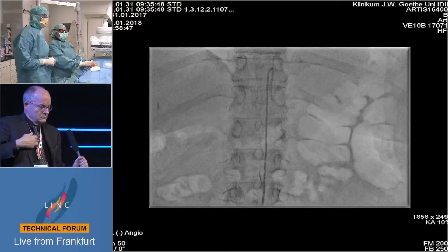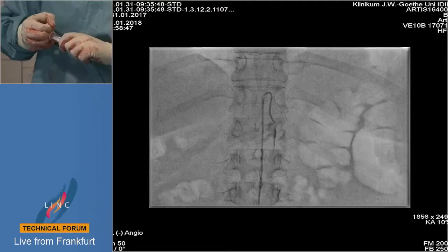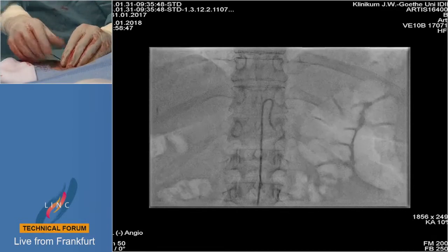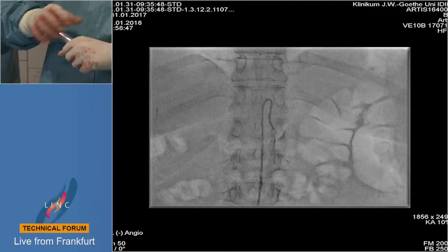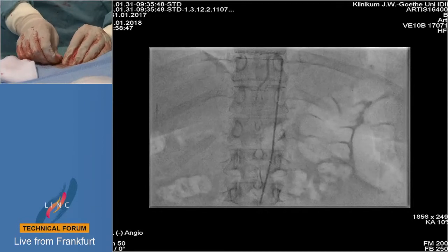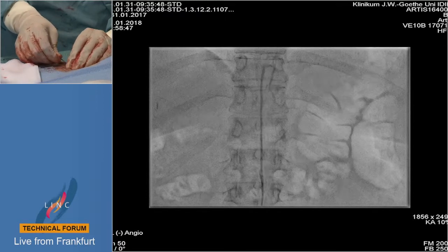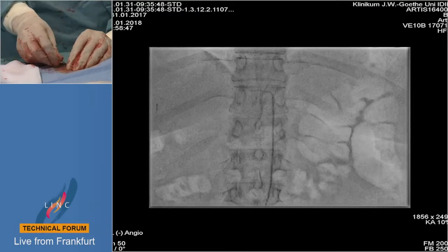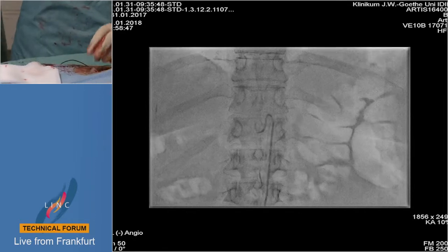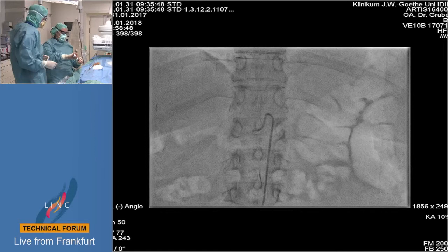So we used at first, after local anesthesia and the puncture of the vessel in the groin, an introducer. It was a 5F introducer. After this first step, we place the sidewinder catheter, and after we have access to the celiac trunk and perform an angiography, we will use a microcatheter. So, I need contrast medium. What type of microcatheter do you have on the table, Dr. Bodel?